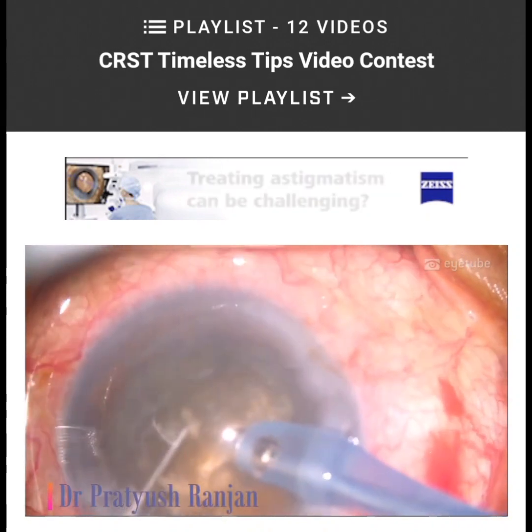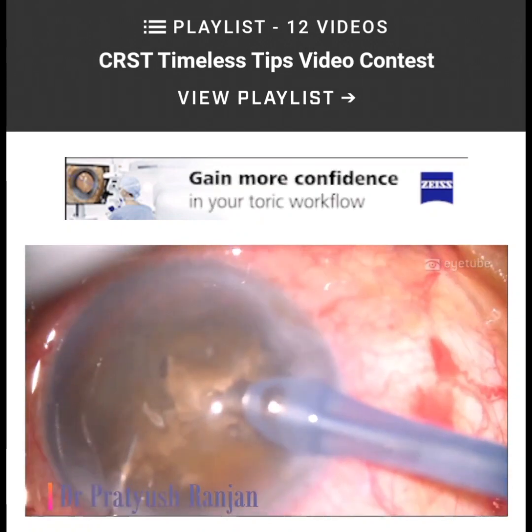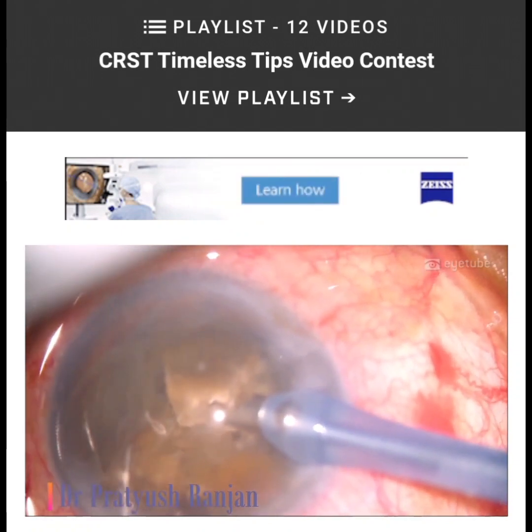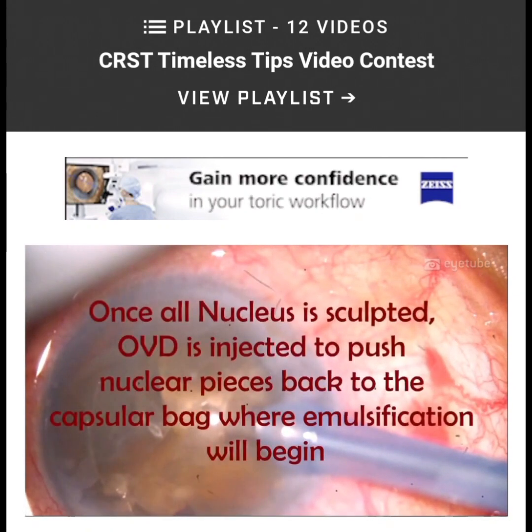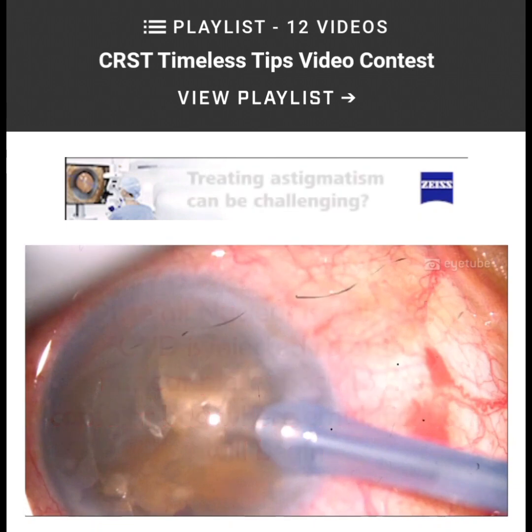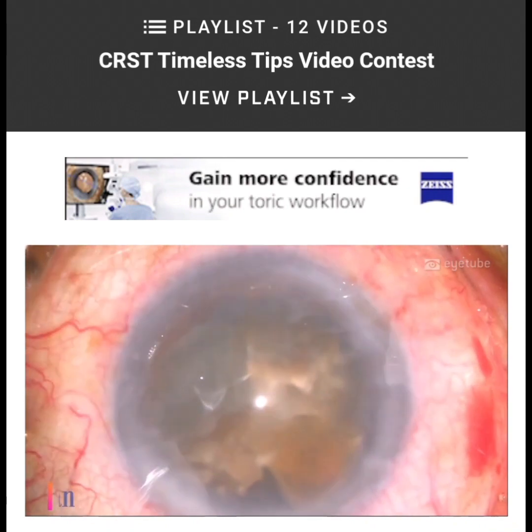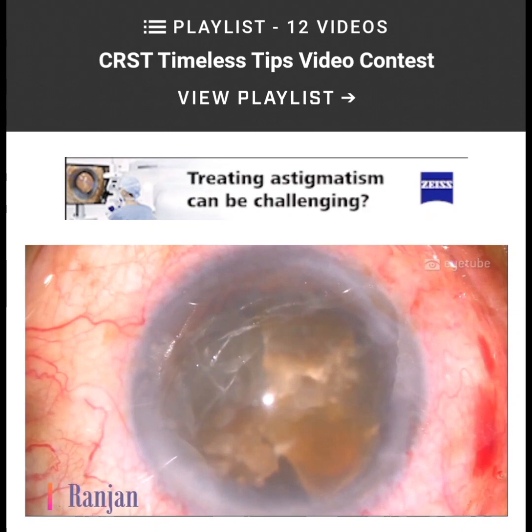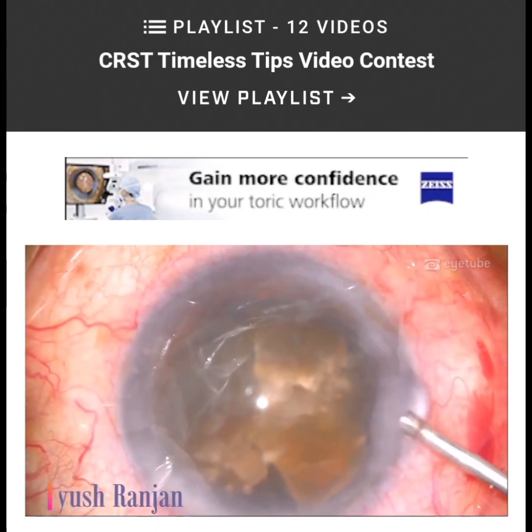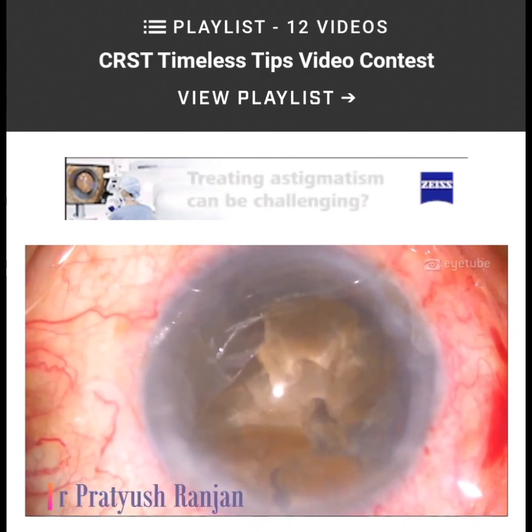After making a trench, you just impale it deep enough so that it holds. Pull the nucleus one pole up and then chop. Once all the nucleus is sculpted, OVD is injected to push nuclear pieces back into the capsular bag, and then you emulsify in the bag. So that makes nucleus management very easy, especially in hard cataracts.